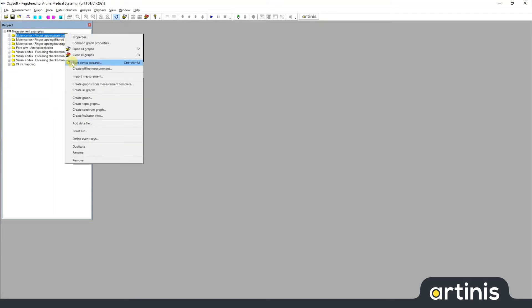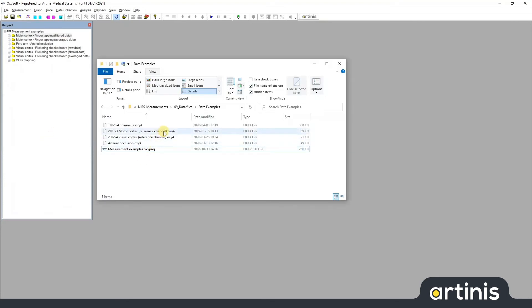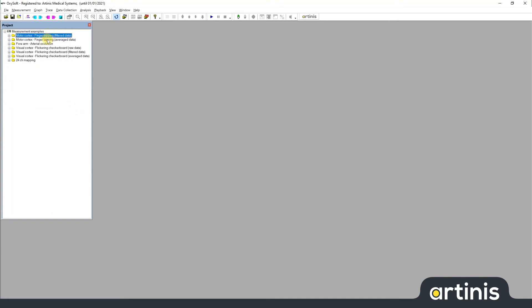To show you how independent these are from the actual underlying files, I'll go ahead and remove this measurement. As you can see in the folder here, the underlying .oxy4 file is still there. And it will be the same even if I deleted all the measurements — it will leave the data untouched. So this is a very important principle to remember: the measurements here are separate from your data files, and any changes that you make in your project file will always leave the original data untouched.